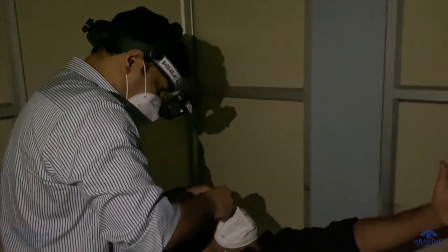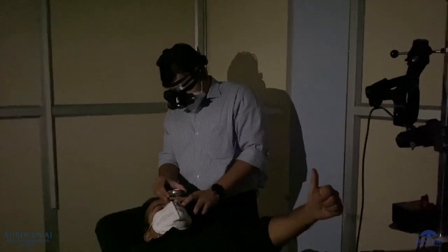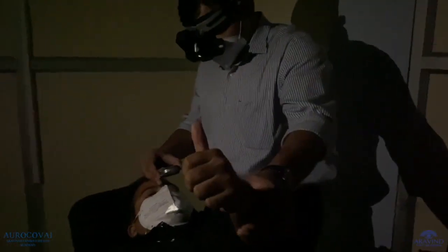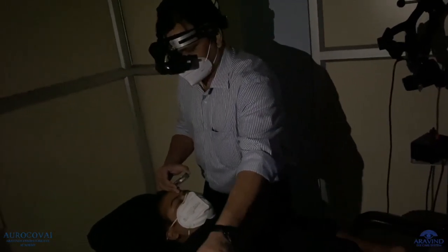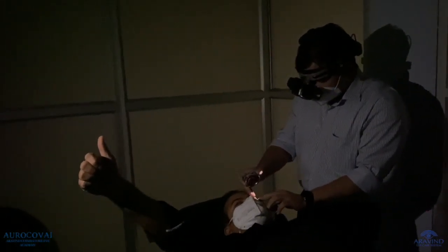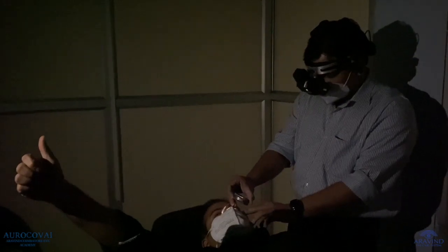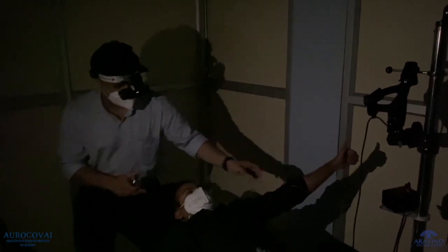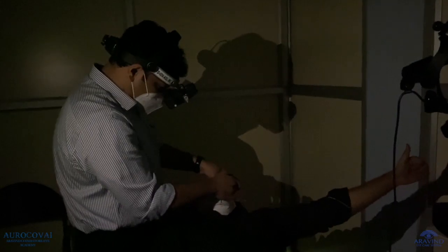The inferior retinal examination can sometimes be difficult as patients are intolerant to light and attempt to close their eyes, including Bell's phenomenon. Hence, throughout the procedure the patient must be asked to keep both eyes open. The examiner's head should be held to look directly into the quadrant being examined. For examination of the nasal periphery, the examiner stands on the same side as the eye being examined, whereas for the temporal periphery, the examiner stands on the opposite side. The patient's head can be rolled towards the examiner for viewing the temporal periphery to avoid the nose being an obstacle. The examiner needs to move around the patient's head to visualize each quadrant while keeping eyes and lens aligned.